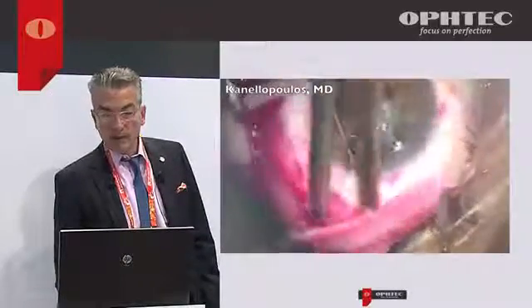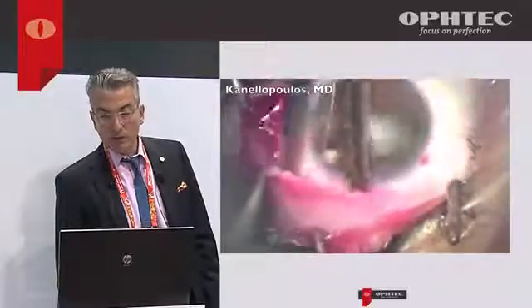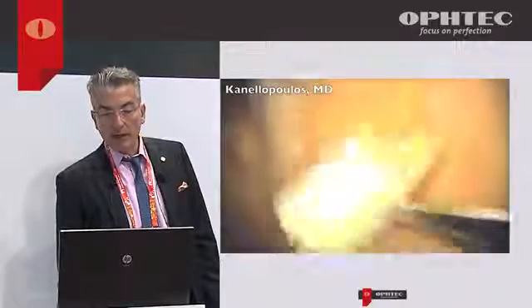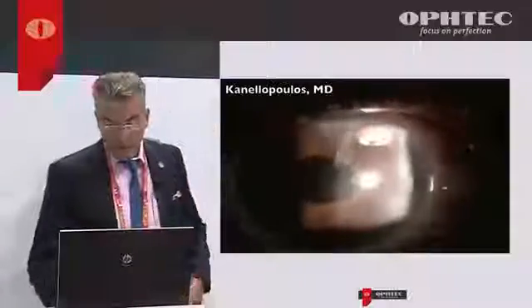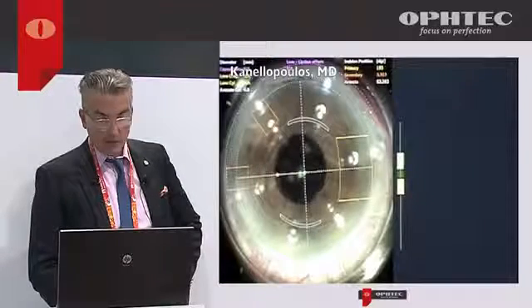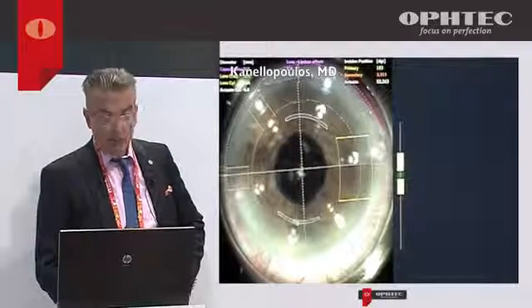So again, lens enclaved, and then a tube shunt for this pediatric 11-year-old boy that was born with congenital cataract. And I'll show you some post-op pictures so we can see the lens is very well positioned. The valve is well positioned as well. And this is an endothelial graft patient that we'll see.